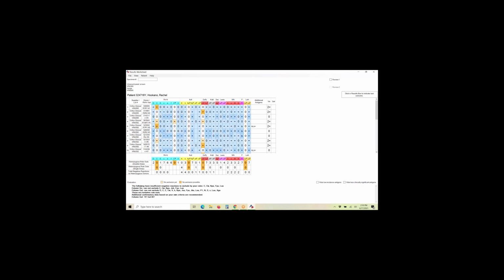We have 1, 2, 3, 4, 5, 6 big C's because we ended up running those 2 panels. And we have 1, 2, 3, 4, 5, 6, 7 Duffy A positives and several negatives for both. So we have a very, very definitive anti-C and anti-Duffy A. So the p-value is probably very good. Now we can save this panel.